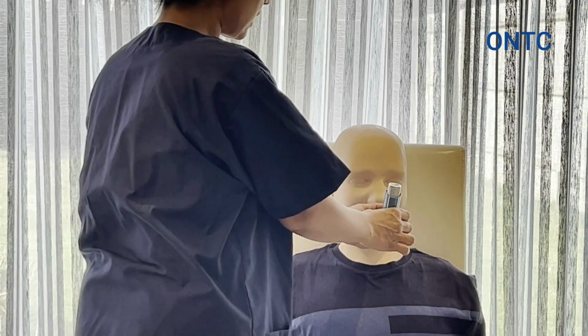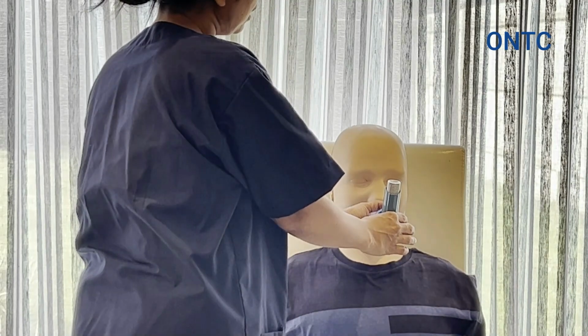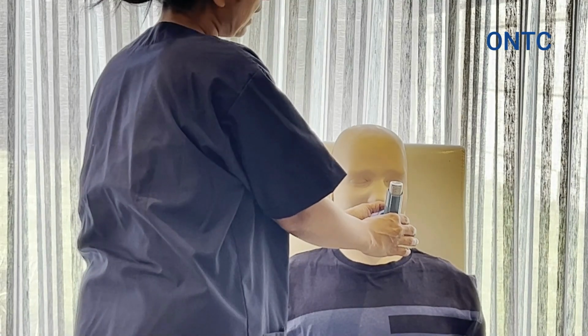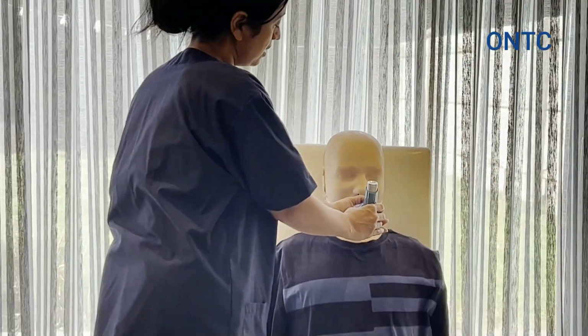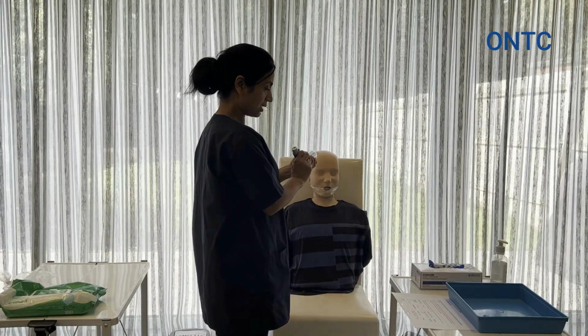So keep breathing in and out 5 times. 1, 2, 3, 4, 5. So yeah, okay, so that's done. Right, we're going to take it out. You can exhale now. I'm going to put this into here for now.